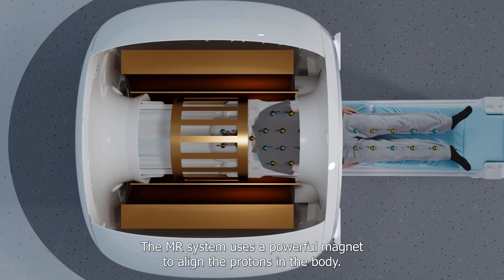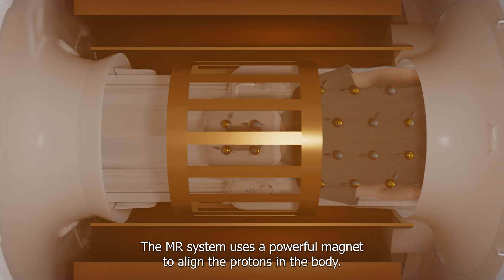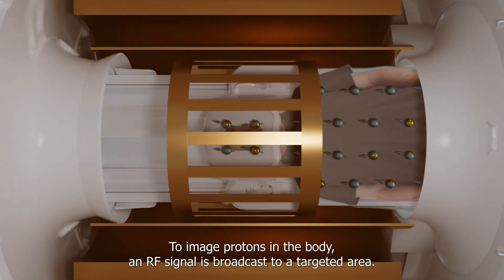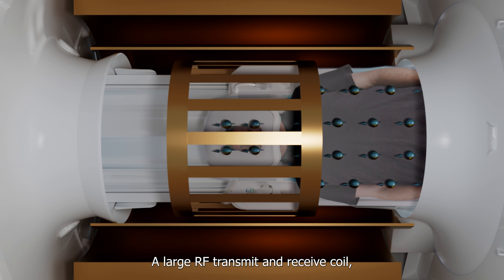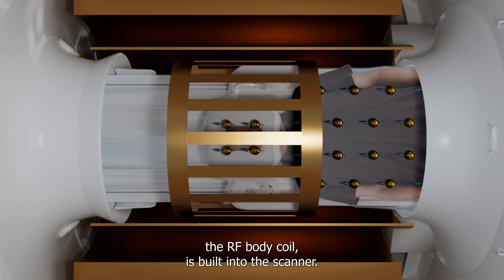The MR system uses a powerful magnet to align the protons in the body. To image protons in the body, an RF signal is broadcast to a targeted area. A large RF transmit and receive coil, the RF body coil, is built into the scanner. The region of interest is placed in the center of the RF body coil, often together with a receive coil.